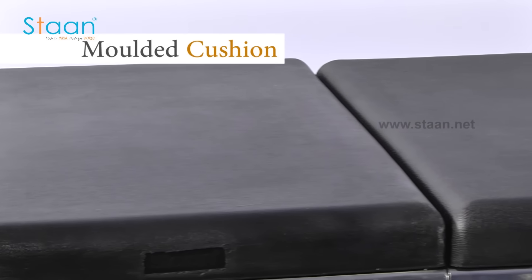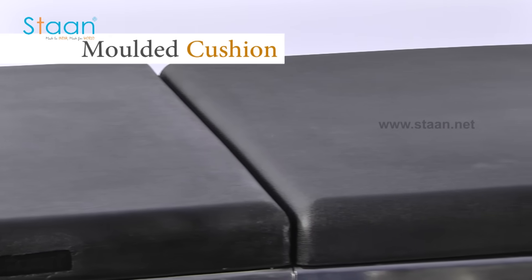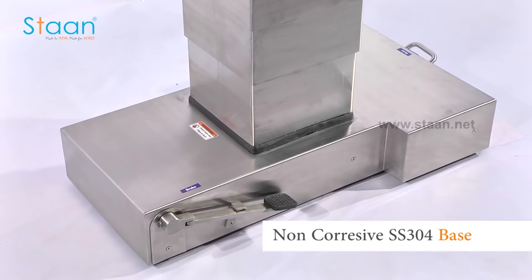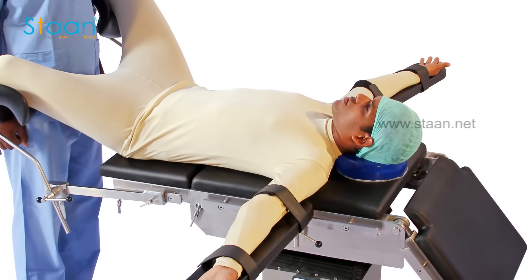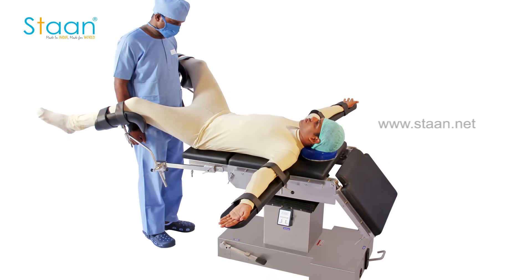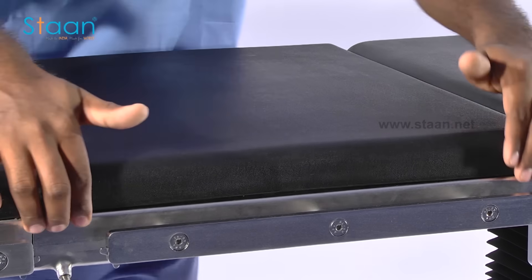The table top is covered by a stitchless polyurethane molded cushion. It has a T-shaped, heavy, non-corrosive stainless steel base that is scientifically designed to provide maximum leg space and comfort for the operating surgeons and the assisting team.